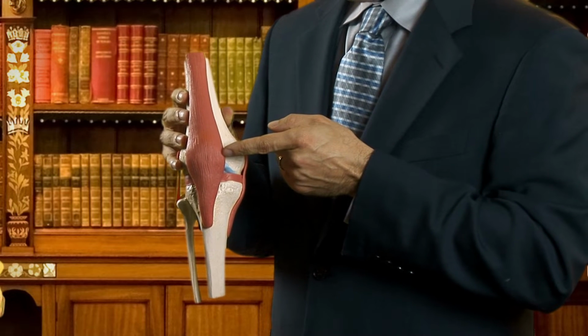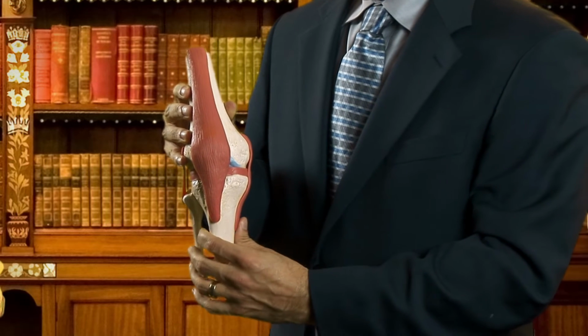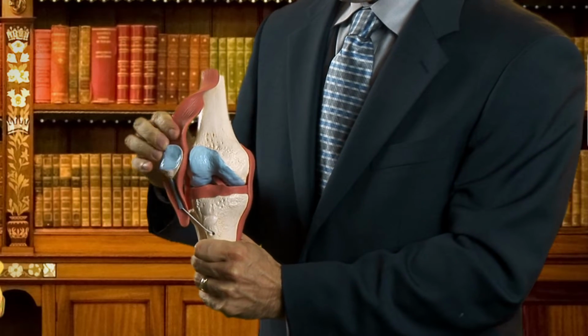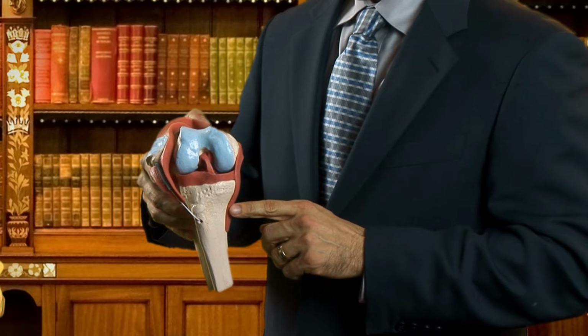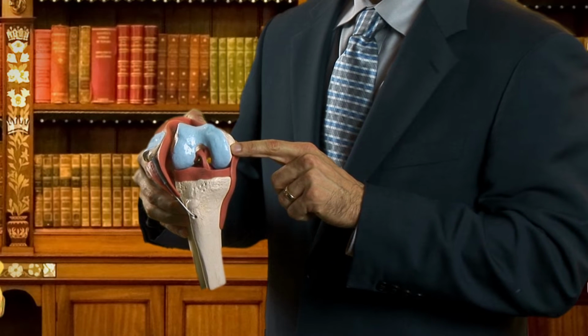However, some surgeons will take this incision either through or beneath the vastus medialis muscle. The surgeon then has the ability to slide the kneecap to the side or evert it in order to get access to the deep structures of the knee. At this point, the surgeon may encounter bone spurs or osteophytes, which can be resected off of the edges.